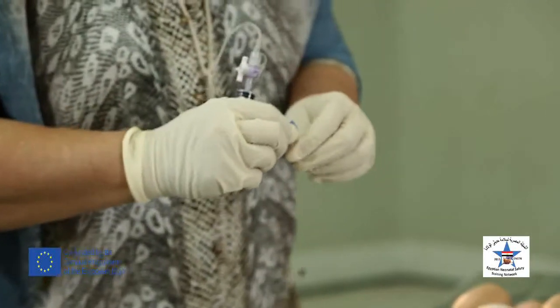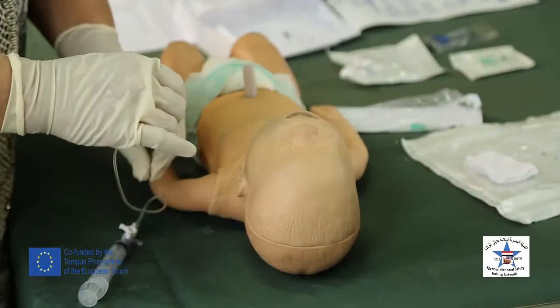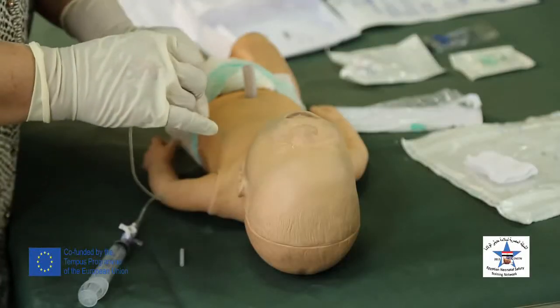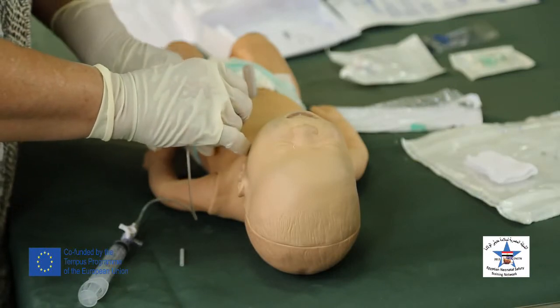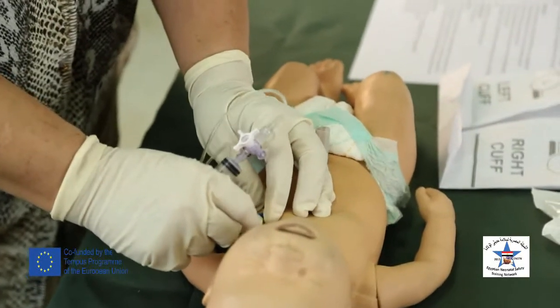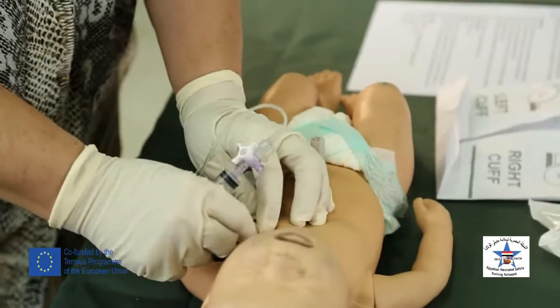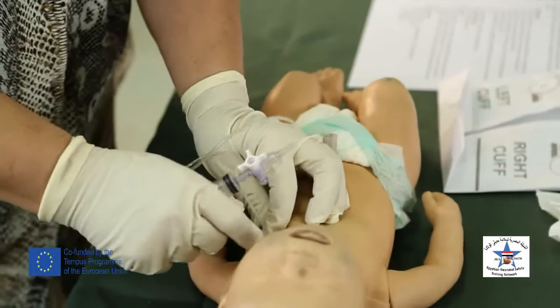At the site of insertion, I will approach the skin and insert the needle perpendicular to the skin and advance downwards until I feel a pop-off or a give-way feeling.